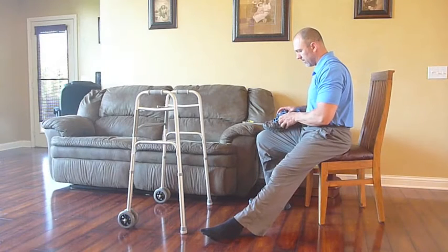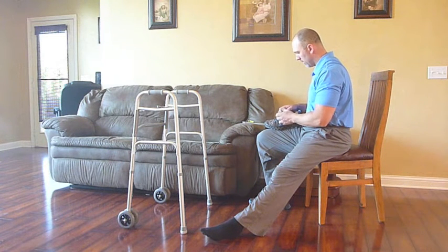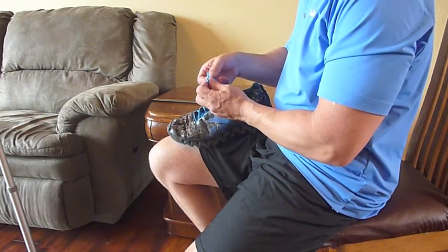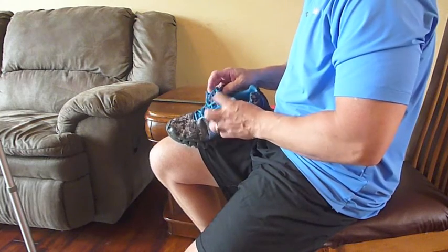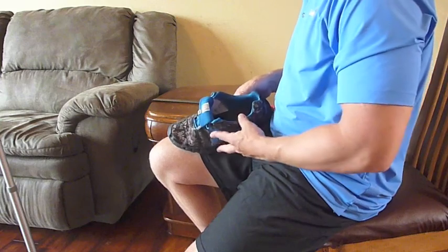Putting shoes on with a long-handled shoe horn. Slip-on shoes are the easiest to use after you have an injured leg. However, if you're using lace-up shoes, simply adjust the shoe to make it a little wider and then retie the shoe. Fold the tongue of the shoe over top the laces so as to get it out of the way.